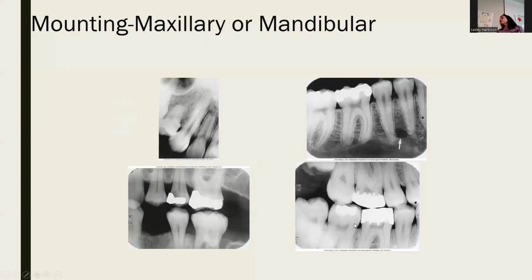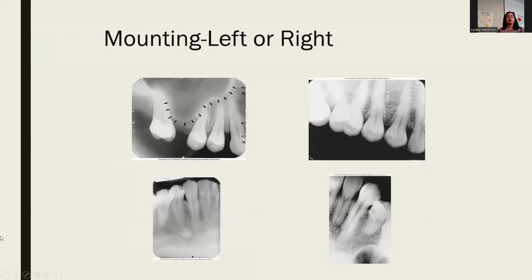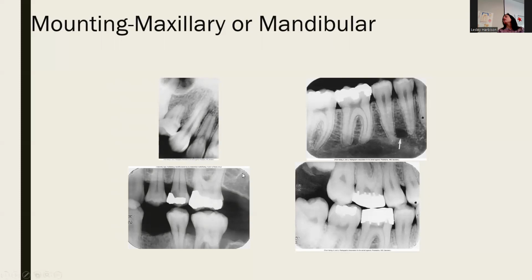And then what about this one? That's a bite wing. Oops. Oh, wait. Did it look like it was correct or incorrect? They're close. They're awfully close, aren't they? But it's correct, right? Good. Yep. You can see a little bit of the ridge coming down through here. You can see there's 2 roots. There's not much of a curve of Spee, but you can see in general that there are other key things to let you know that that's correct.